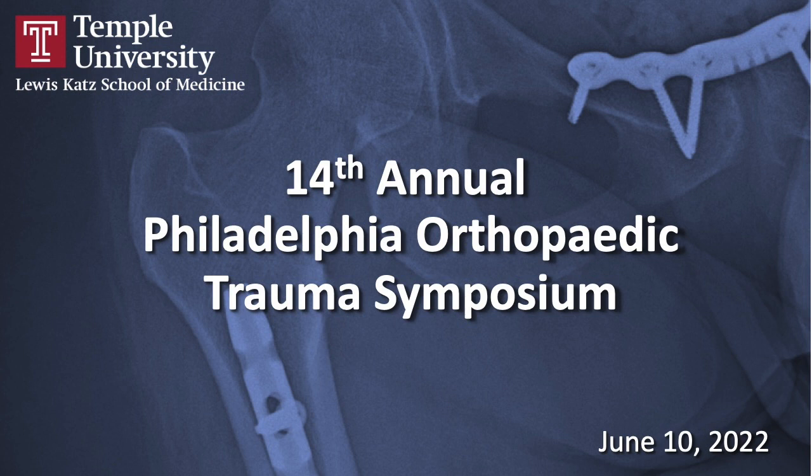Yeah, Susan, go ahead. If I could just add one more thing about pin sites, because it's so important. One of the things that was mentioned was what order to put your construct together in. One thing I like to do, if it's a really gnarly broken open fracture, with very dirty, contaminated soft tissues, not just a little poke hole but a real honest-to-goodness mess, is put my pins in. I cover that with, like, Ioband or something at the initial prep and drape.